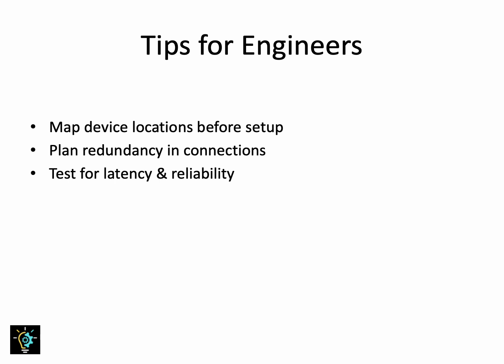So what can engineers and technicians do to get this right? First, map out where devices are located before setting up the network. Knowing that the ICU has 10 ventilators and 5 monitors helps guide the number of ports in the physical layout.